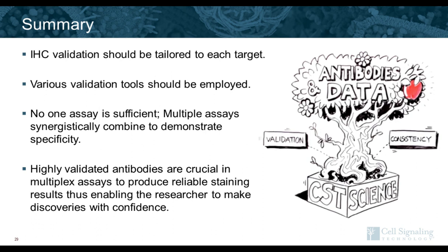Thank you. And try to reword this question. Does the OPAL technology permit detection of intracellular targets? Yes, just like in standard single-plex chromogenic IHC on FFPE tissues. The OPAL kit can detect proteins that are expressed on the membrane, in the cytoplasm, and in the nucleus. So it doesn't necessarily matter where your protein is expressed. You can easily detect it with both chromogenic IHC and the OPAL technology.